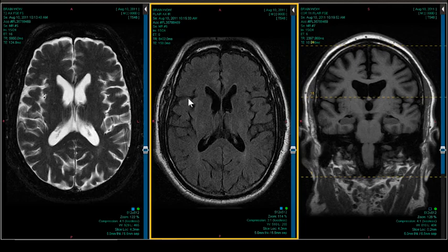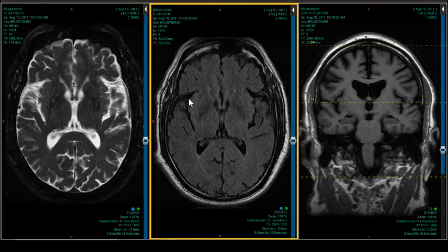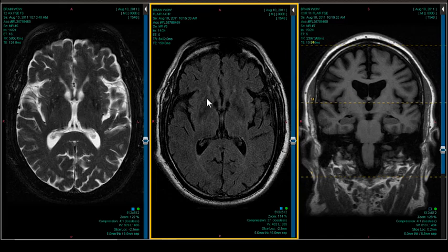So this patient has caudate and basal ganglia atrophy. I think the caudate and putamen are atrophic. I mean, look at the size of the putamen. It's this minuscule little sliver of a thing, right? And it also has a little bit of high signal on the FLAIR.